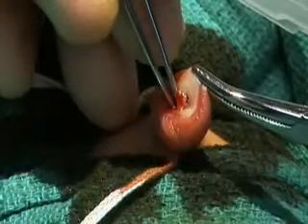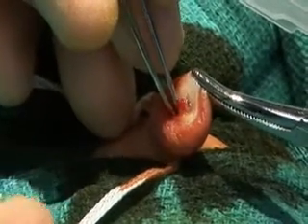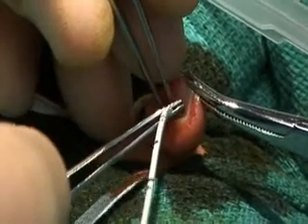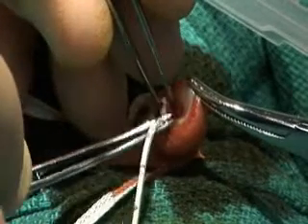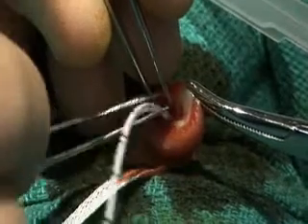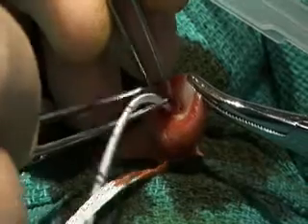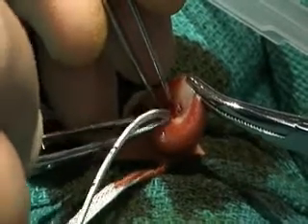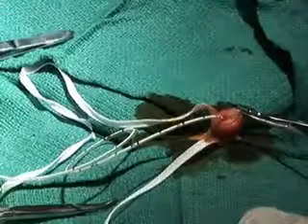Use your dominant hand to grasp the catheter 1 centimeter above the lumen using the other mosquito forceps, or using the thumb and forefinger, and slide the catheter between the tips of the forceps within the umbilical artery. Using a firm, steady motion, pass the catheter 1.5 to 2 centimeters into the artery and remove the indwelling forceps. Grasp the cephalad portion of the cord with the toothed mosquito forceps and apply traction in the cephalad direction to assist in passing the catheter deeper.